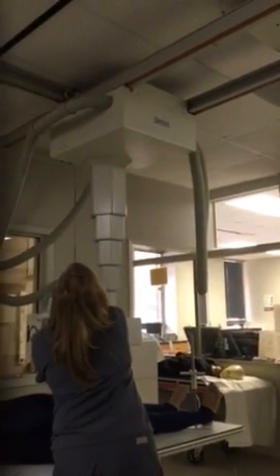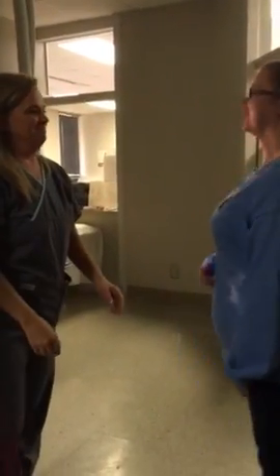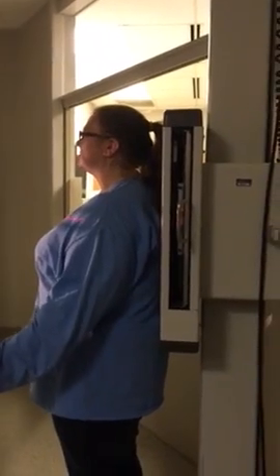72. Alright, I'll let you do the patient again. Okay, facing me. Back against the board. And you got a 14 by 17 in here transverse. Wow. Y'all gonna let me leave it there, right? Nobody's gonna say a word. I didn't know what you're doing. I didn't either. 72, we're gonna do AC joints.